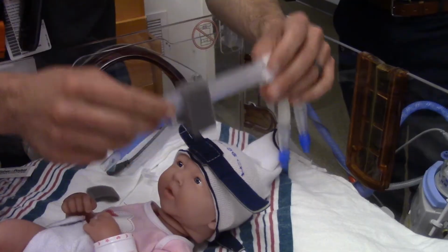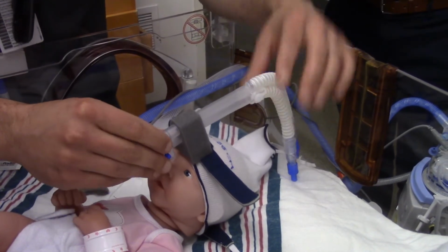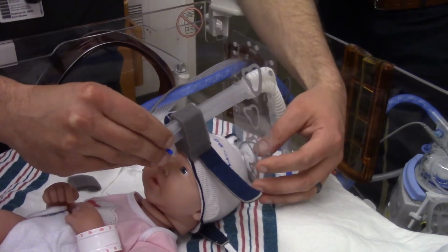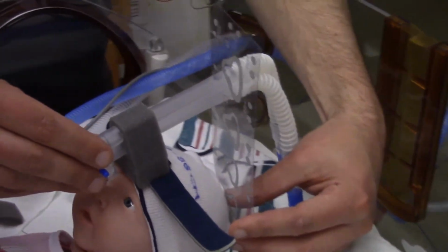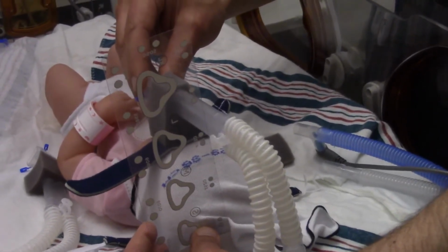If we were to put the 100, which is in my hands now, on top, we can see that the frosted part, Connie, if you want to come on over on this side, a little bit to your right, you can see that the frosted trunk goes well past the baby's head.